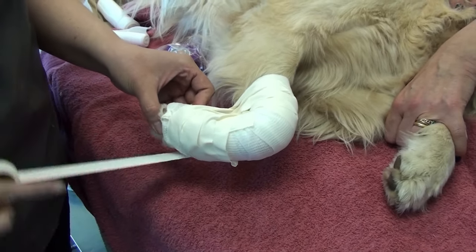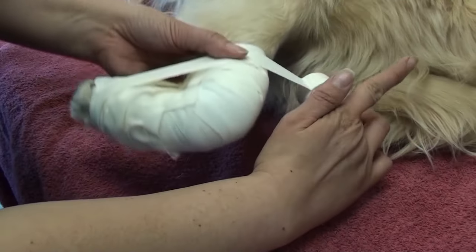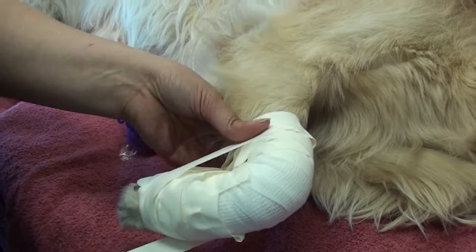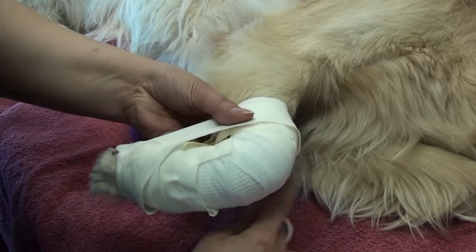She's finishing by just doing a direct loop around, and this is just to add a bit of security to the job that she's already done.